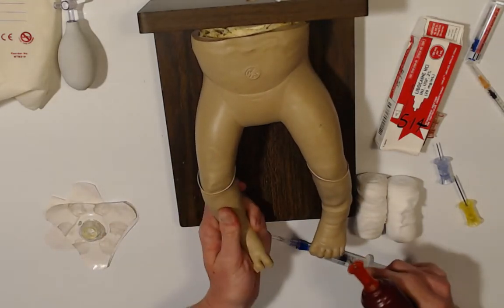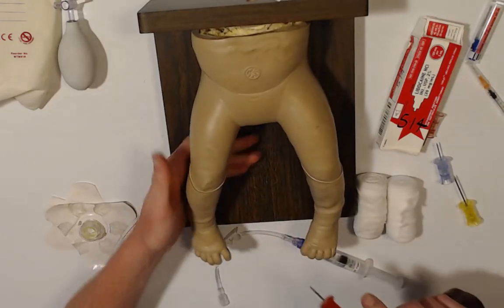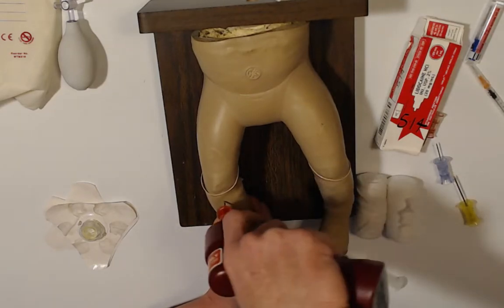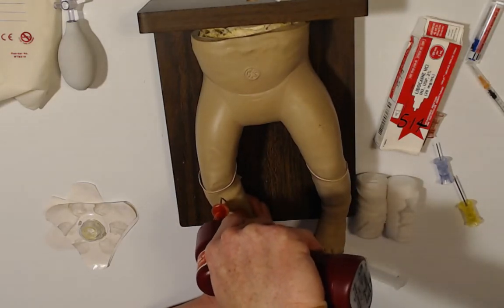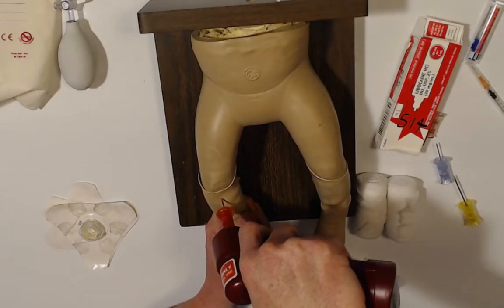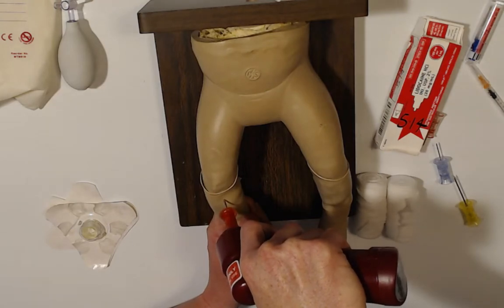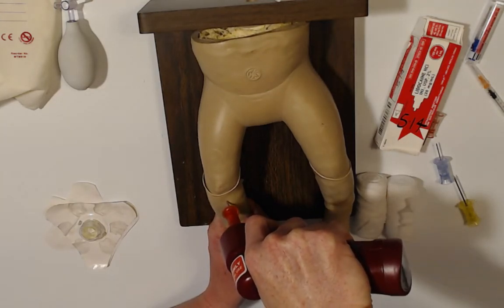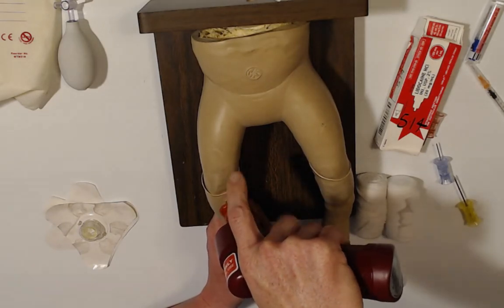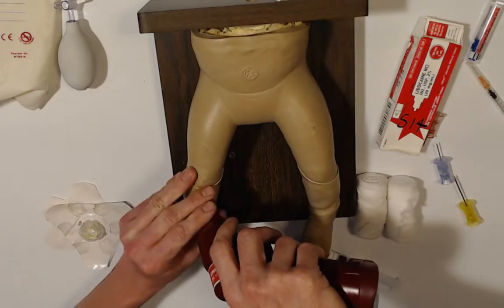I'm going to kind of hang on to my foot. You never want to hold right behind because we don't want to accidentally drill through and hit our hand. So I grab him by the heel. I'm going to first punch through the skin, feel it hit the bone, and then I'm going to go ahead and pull my trigger. And again, I'm listening for it and almost feeling that pop. Okay, as soon as it goes, that's it. Let off the trigger. It'll probably rotate a couple more times to really seat itself.